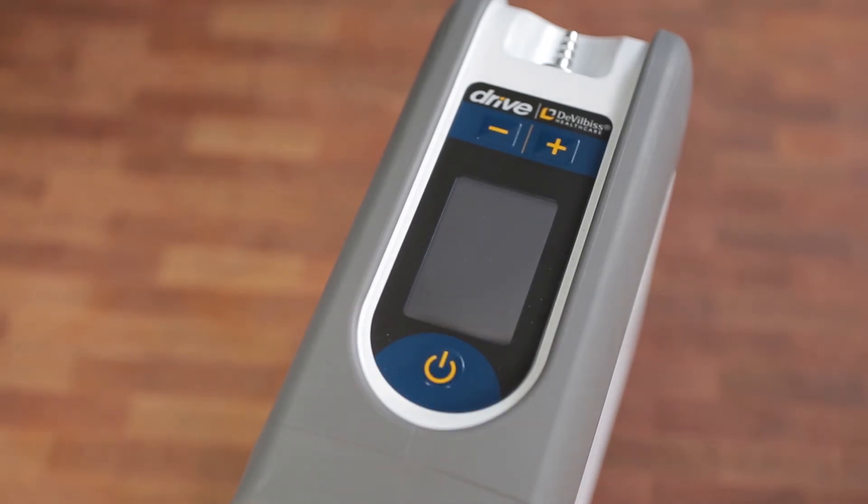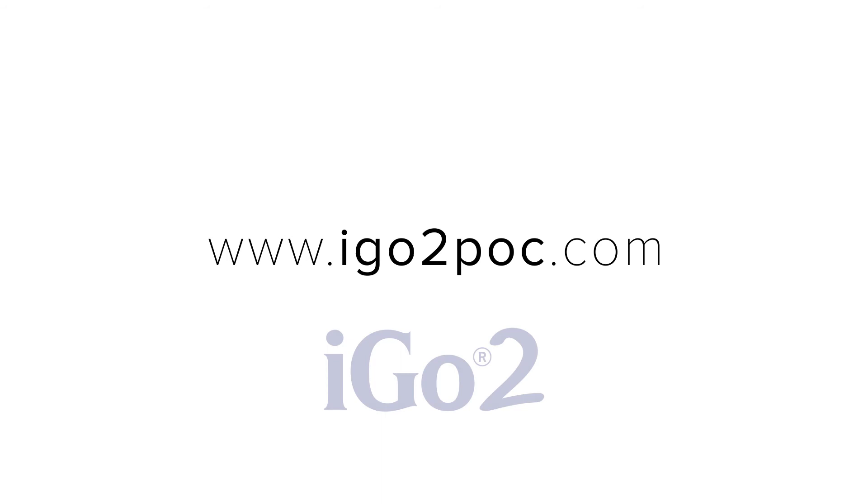You're all set to start using your iGO2 portable oxygen concentrator. Thank you for choosing Drive DeVilbiss Healthcare.